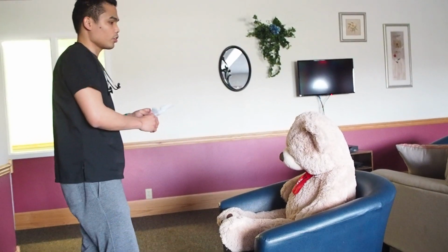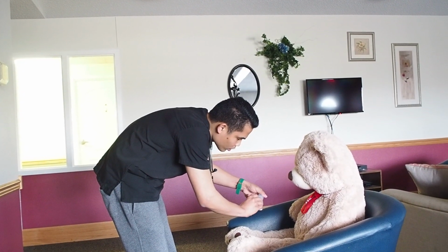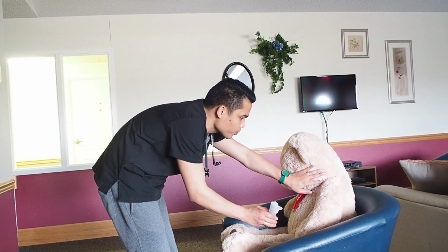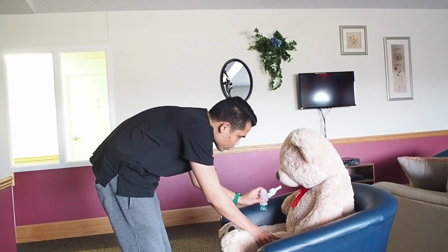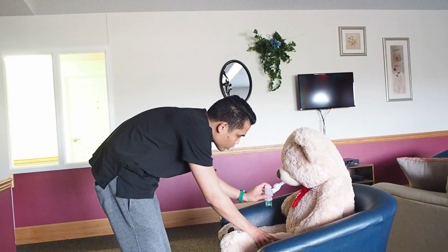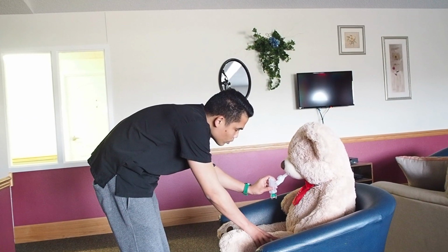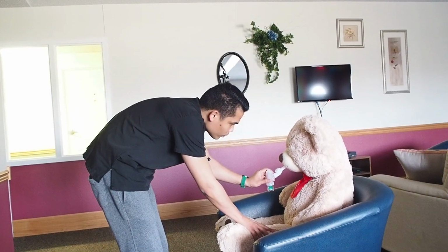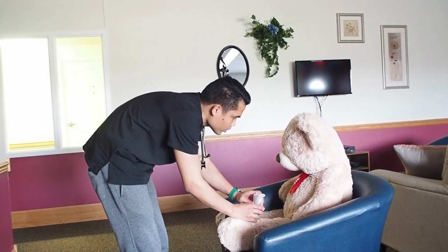Okay? So we're going to start. I'm going to twist this for you. Okay. And then exhale all your air out away from the device. Okay, very good. So put this inside your mouth. And then I'm going to count 1, 2, 3 for you to do a deep inhalation. 1, 2, 3. Hold your breath. Okay, hold your breath. And good. Remove and exhale normally.